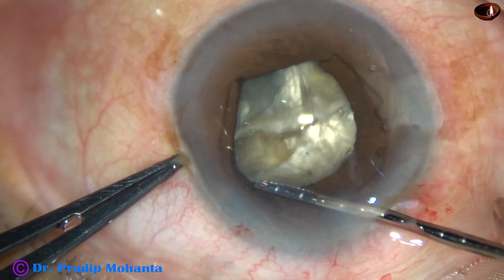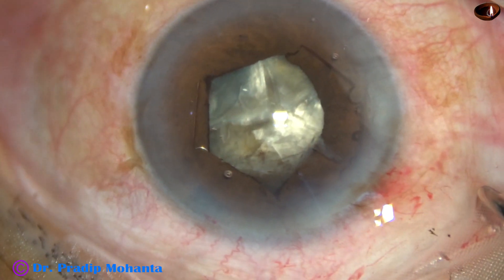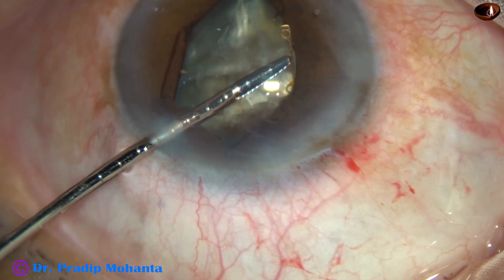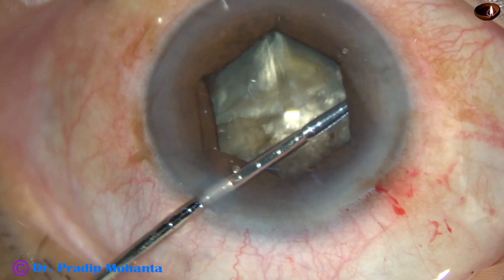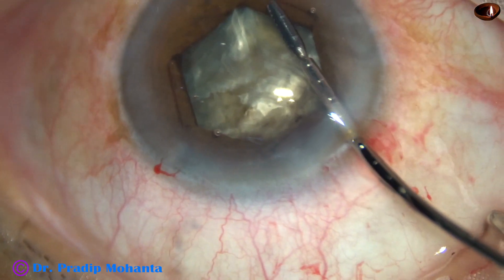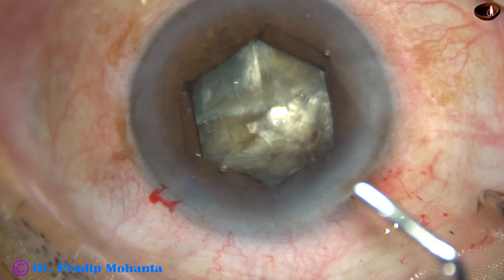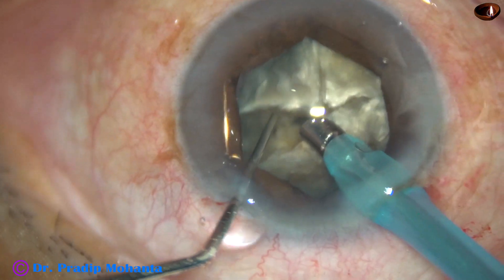Two flanges have been tucked through the main incision. It was necessary because I don't have a side port on the right side. Through the left side port, with the left hand, the flange at 10 o'clock is tucked. I check if the flanges are under the capsule or not — the capsule is free all around. The pupil has dilated to about 5.5 to 6 millimeter.